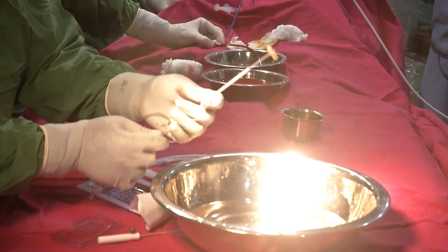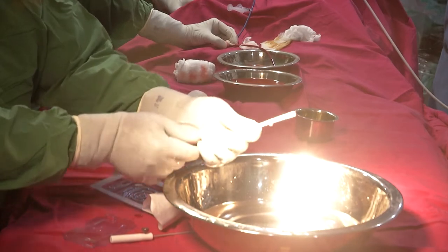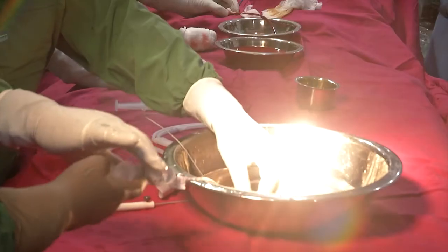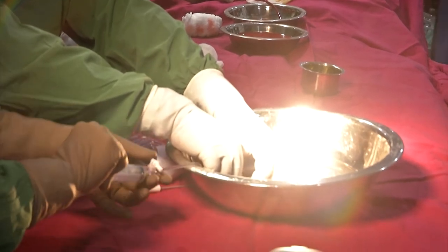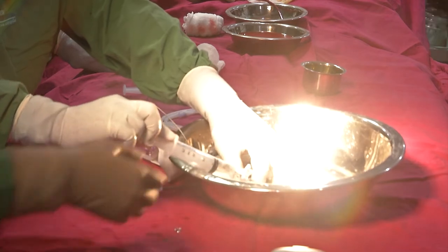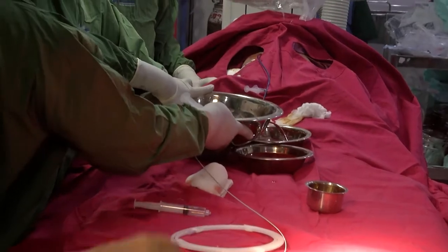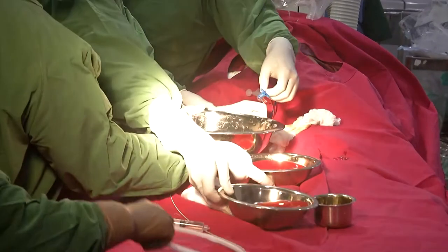This is a 12 size which was pre-planned. So we have planned the smallest size, as small as possible. It is better if it slips out. We can again change it to a larger size, but try to give a smaller size, as small as possible, because this is the atrial septum through which the sinoatrial node is communicating with the atrioventricular node, and we must be careful about the conduction system.